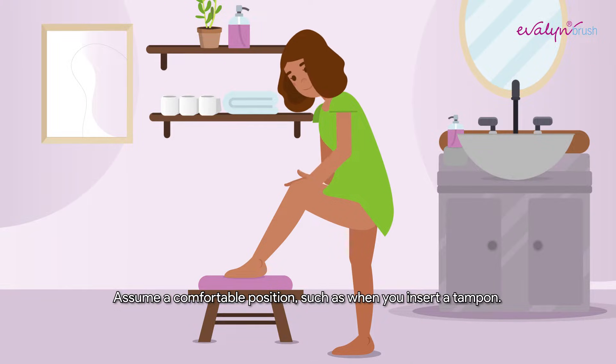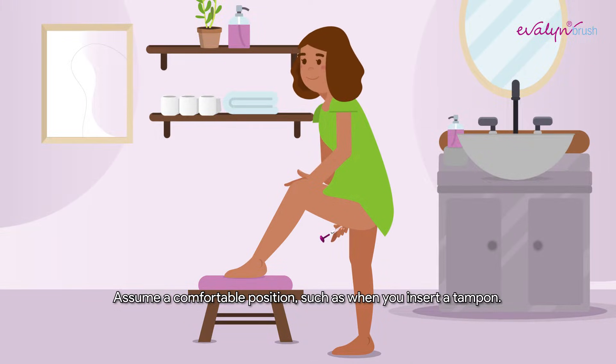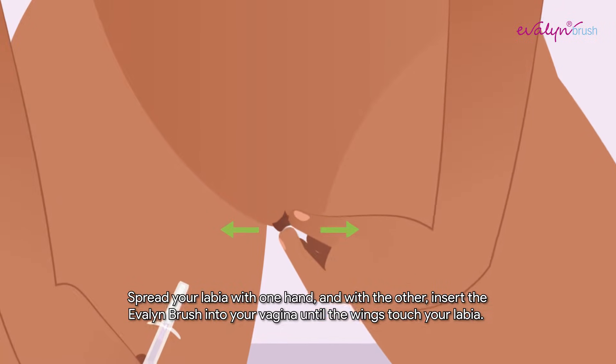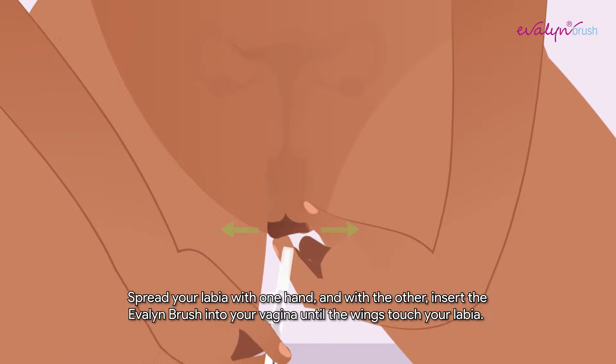Assume a comfortable position, such as when you insert a tampon. Spread your labia with one hand and with the other, insert the Evelyn Brush into your vagina until the wings touch your labia.